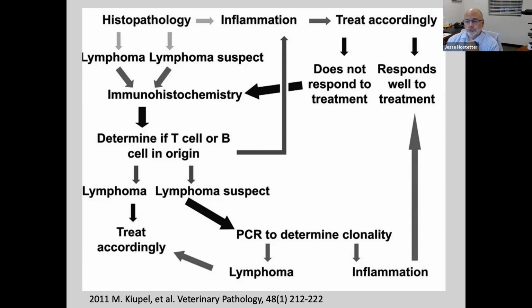Three-year-old cat, poorly preserved, jejunum perforation, monomorphic lymphocyte population, but only in the submucosa and muscularis. Possible lymphoma without mucosal lesion. The answer, I would say, is yes. And I would wonder what kind of biopsy it was. Of course, it's full thickness, but how much did you have? It may be that in a region adjacent to where your biopsy came from, it was more of a full thickness and it was in the mucosa, and then was spreading out in the submucosa and in the muscularis into adjacent areas of the intestine, and that would be maybe how I would interpret that.